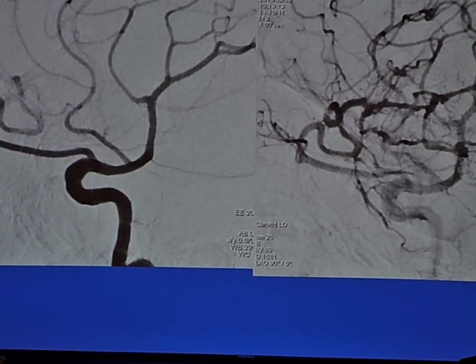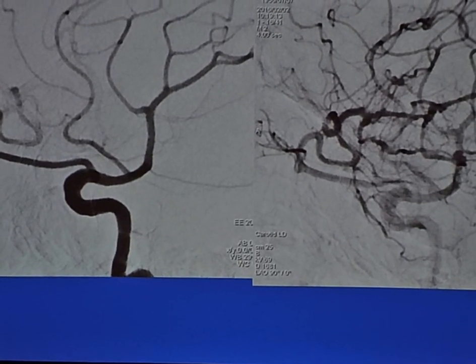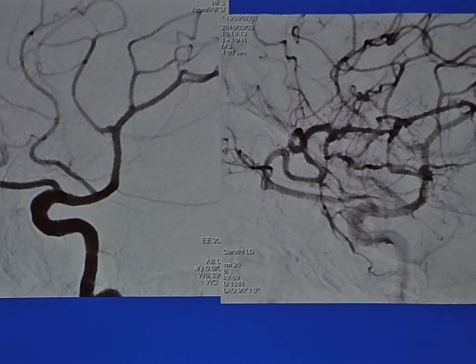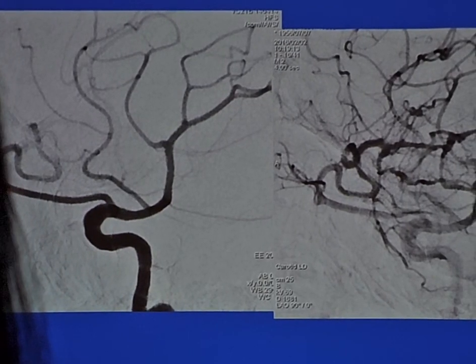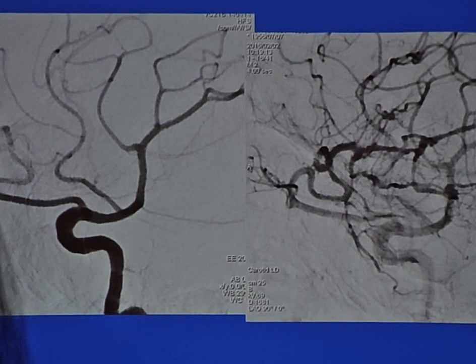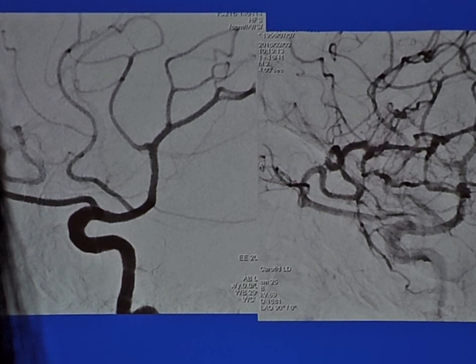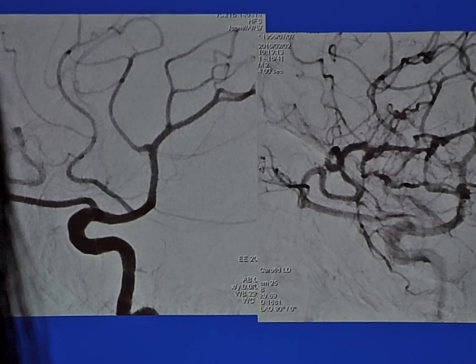Safe to embolize, not safe to embolize. Answer is it is safe to embolize if you know where you are. So if you know where the vessels come off to the retina, the choroid, then you know it's safe. Because if you get a microcatheter all the way distal and onto the tumor, it's going to be safe to embolize. Just don't reflux to this point. That's the point of knowing all this anatomy. If you know where the vessels come off, it's going to make it much safer to do treatments.